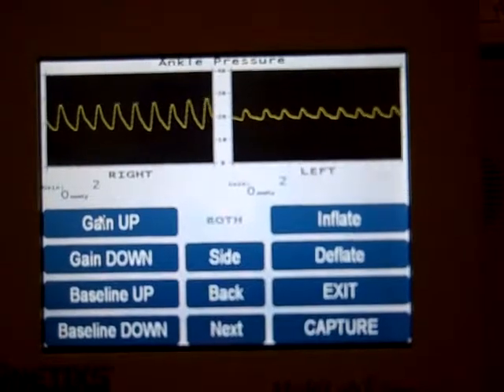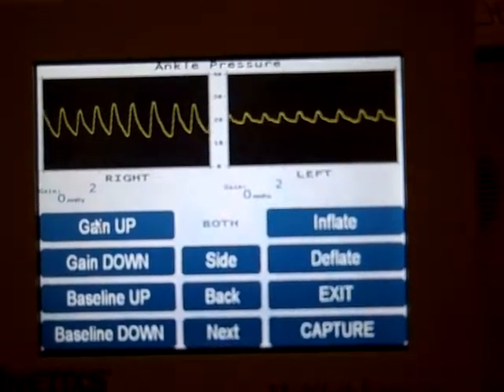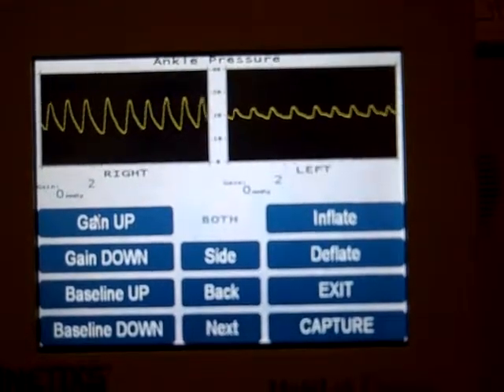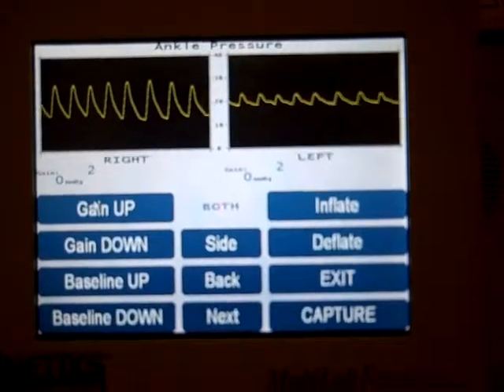I've got the right sensor on the right toe and the left sensor on the left toe. It's a good idea to adjust the gain on the sensors so that the waveforms take up about half the waveform box or less.